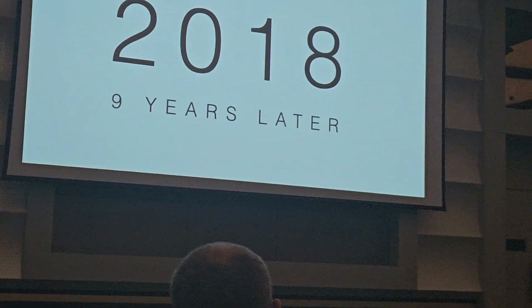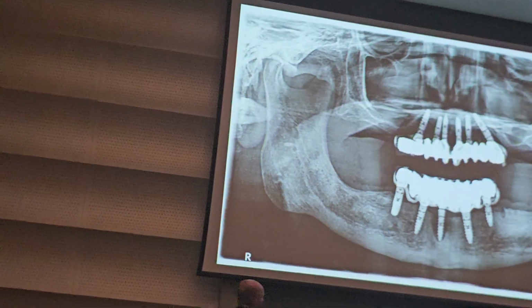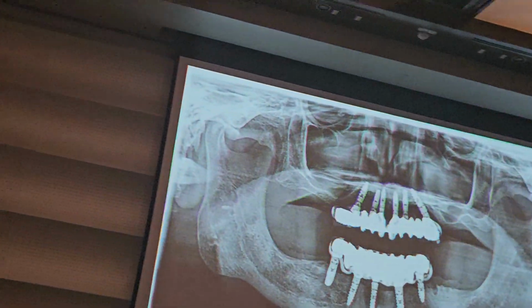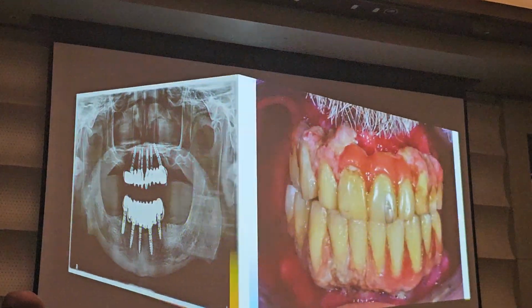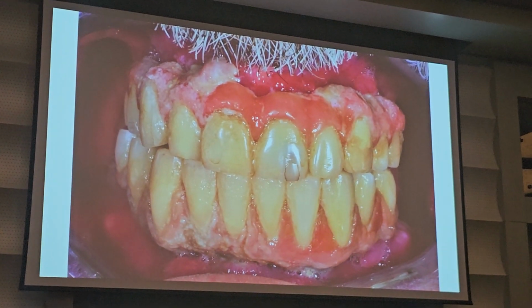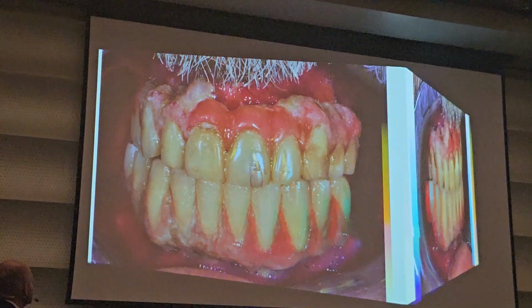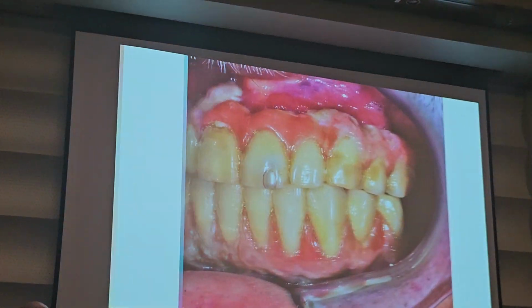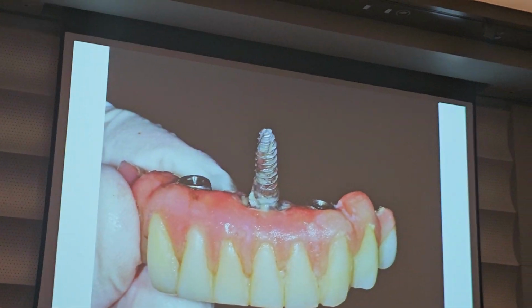2018, 9 years later. So, I noticed something wrong on these implants. I didn't say anything to the patient. I just asked him for a procedure just for cleaning, to remove the implants. But this was the hygiene of the patient as well. He didn't notice he was staying without one implant.